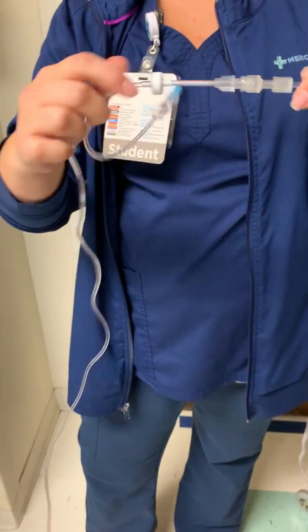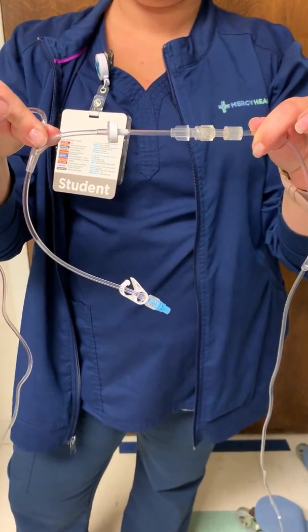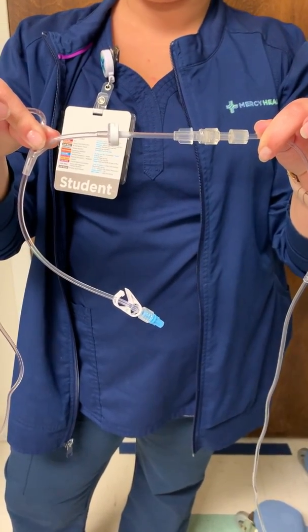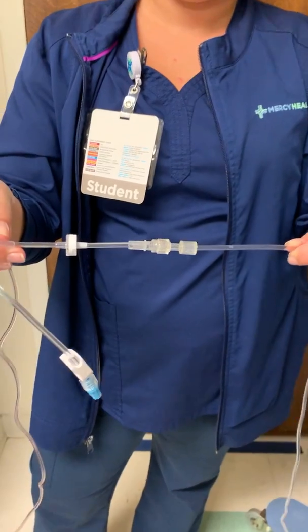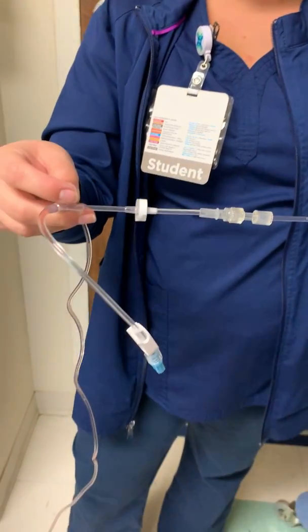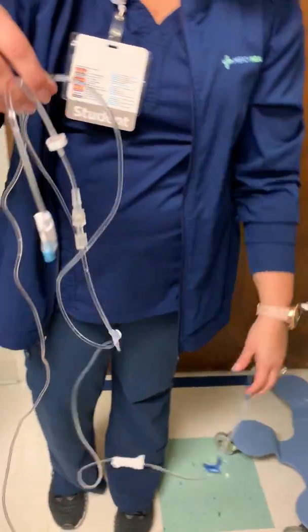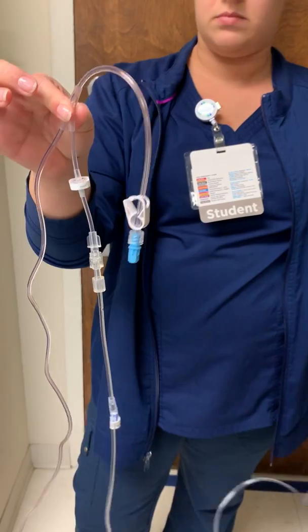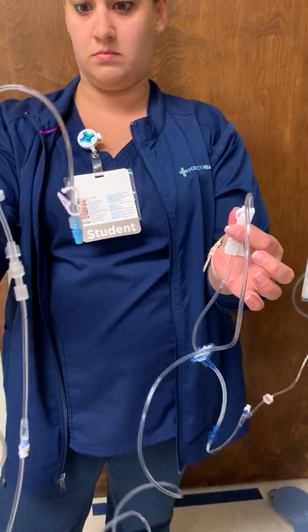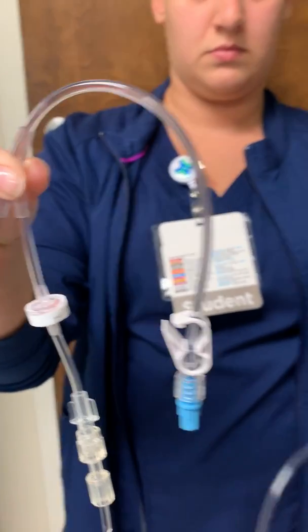There is a back check valve, see right there, and what that will do is it will prevent the medication from flowing backwards into the primary tubing. If you don't set it up this way, that medication could flow back into your primary, and you wouldn't want that to happen. Then you cap your end. And now we're going to prime the short end, that little piece that's left of the IV PCA tubing, using the primary fluid.